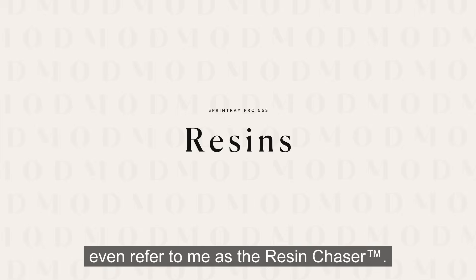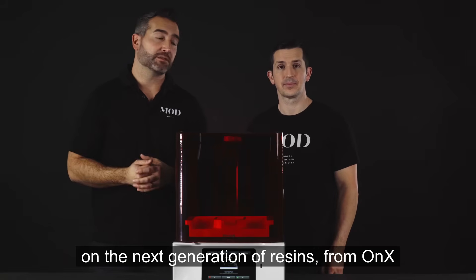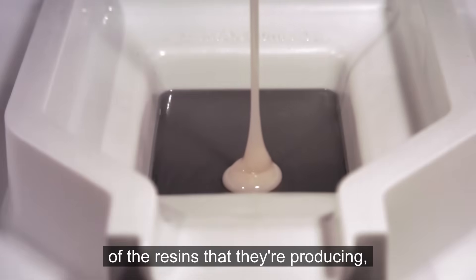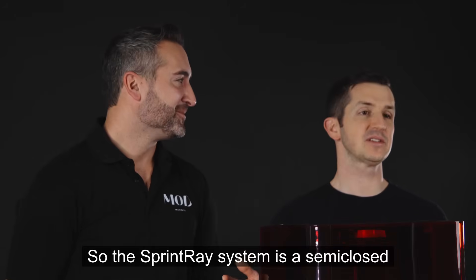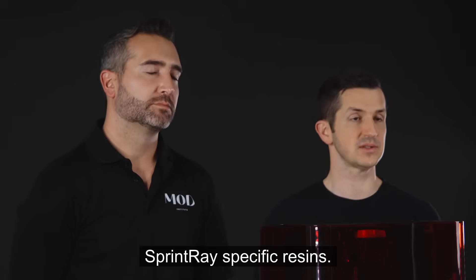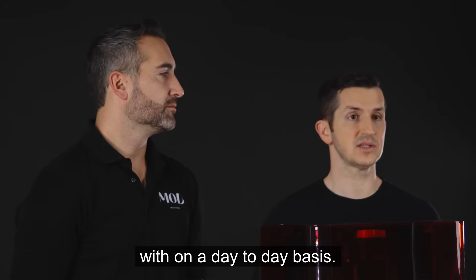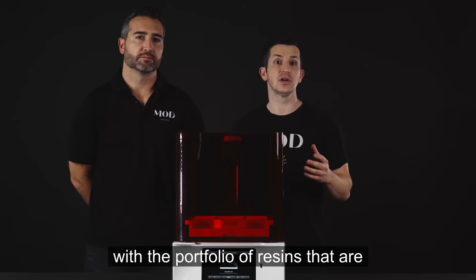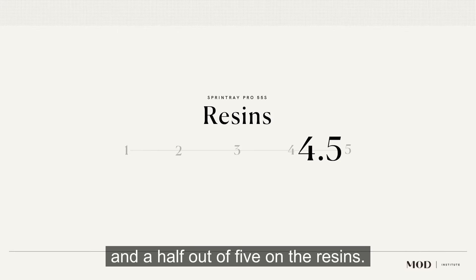It's all about the resins. Sprintray has really spent a lot of research and development recently on the next generation of resins. From OnX to OnX Tough and Nightguard Soft, they've really stepped up the quality. The Sprintray system is a semi-closed system, meaning the majority of validated resins on the Pro 55S are Sprintray-specific, though there are some third-party validated resins available. They have a variety covering pretty much any indication a busy dental office would need. We're going to give it a 4.5 out of 5 on resins.